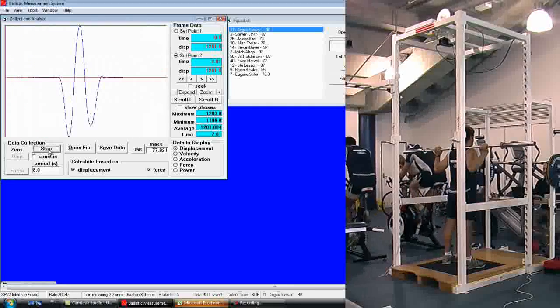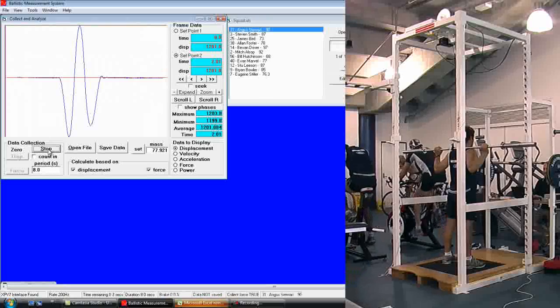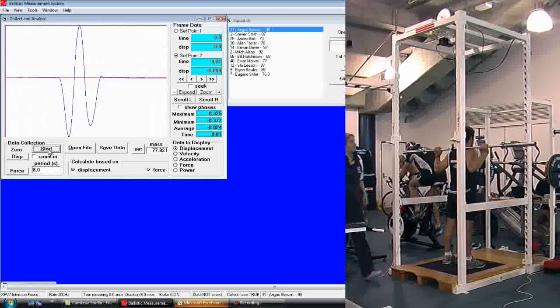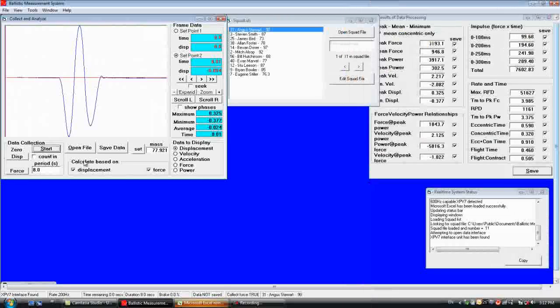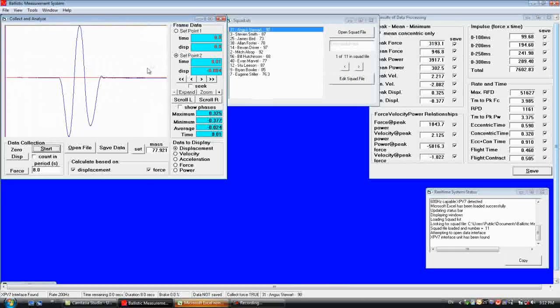They perform the CMJ. We get them to stand still at the end to get a flat portion of graph on the way out, and then get them to rack the bar.